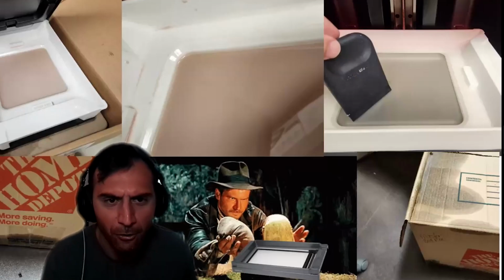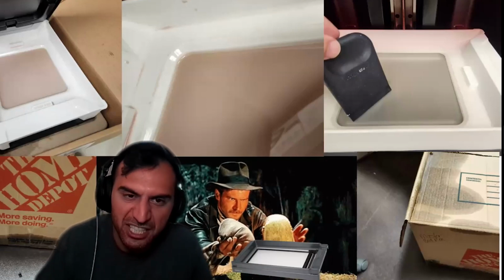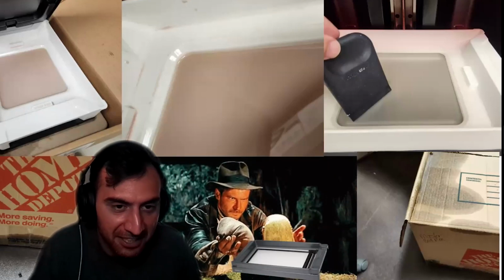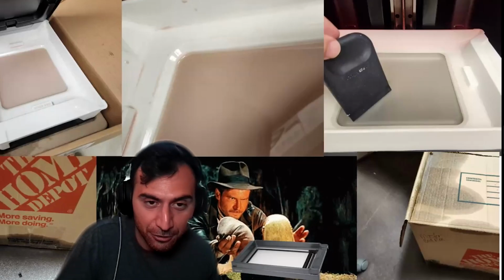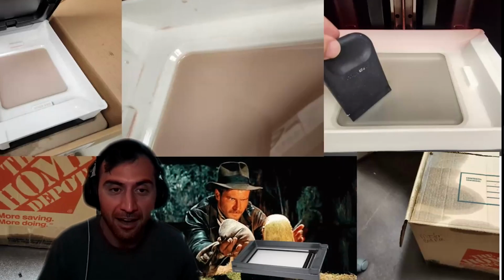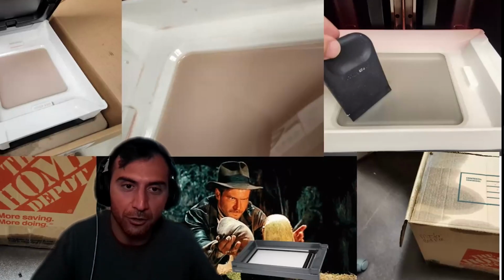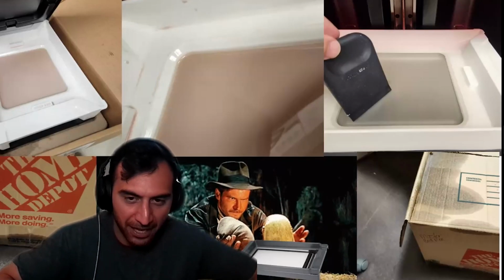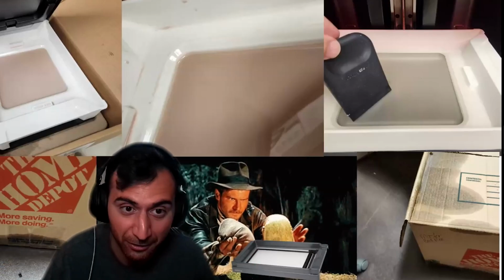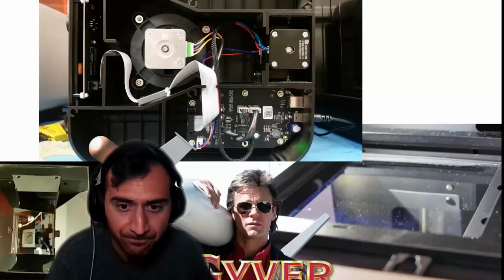You can wipe things with alcohol, and you have to be very careful carrying around the trays. You're changing tray material. Like I said, if you want to print a denture, you have a different tray with different resin sitting in it. If you want to print a surgical guide, you have a different tray with surgical guide resin in it. For example, on my Onyx, I have a tray with Onyx resin in it. When I go to put it on, I have to be completely flat. If I turn a little bit, it'll spill out and also mess with the tray. If it gets underneath the tray, it can ruin the trays.